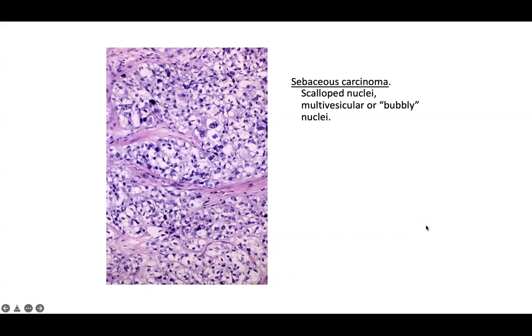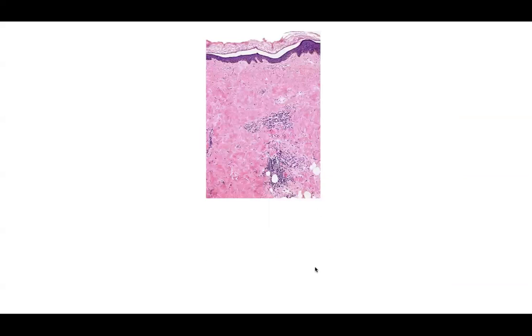The differential for a clear-cell tumor may include balloon cell melanoma, metastatic renal cell carcinoma, or other dermal clear-cell tumors. You can even have clear cell change in basal cell carcinoma or basal cell carcinoma with sebaceous differentiation. We'll stop here and start the next slide in the following lecture.